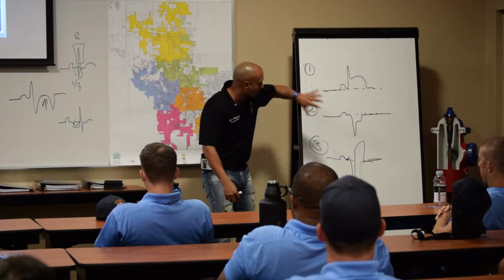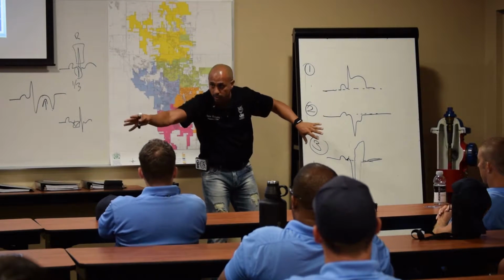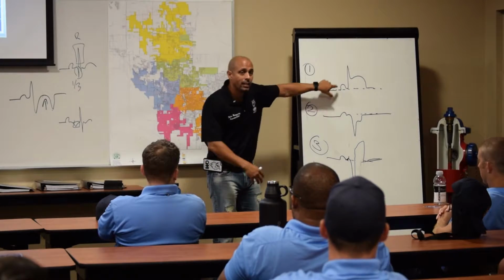So I want to reiterate, if I have a left bundle branch block or a ventricular pacer and it's old, they have a history, I look for this.